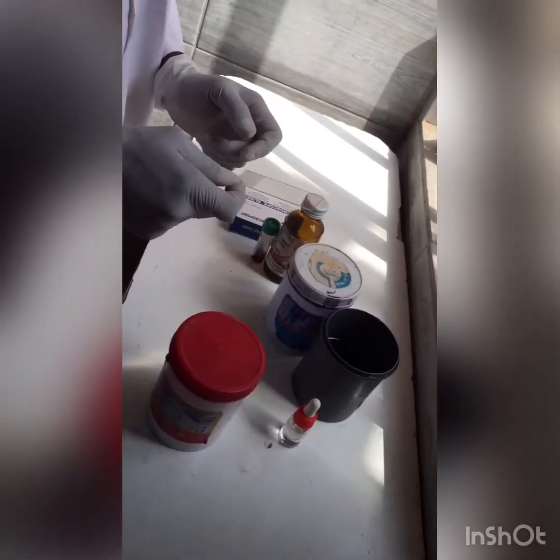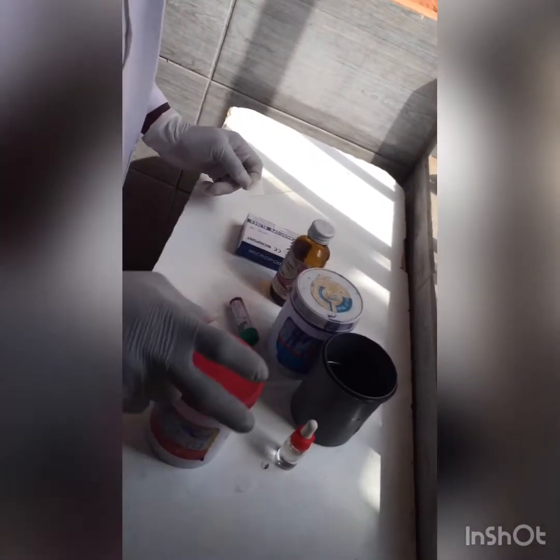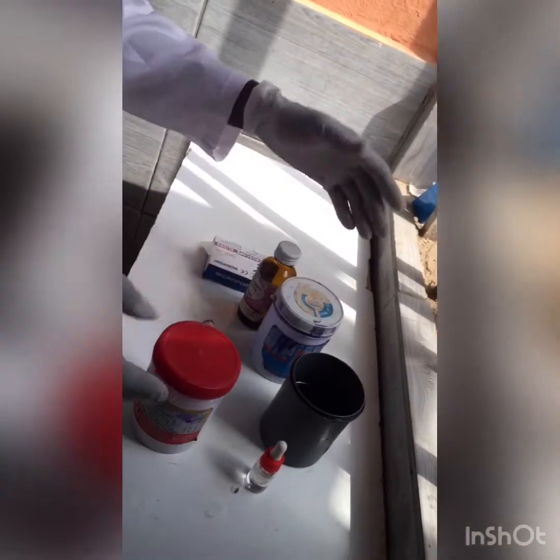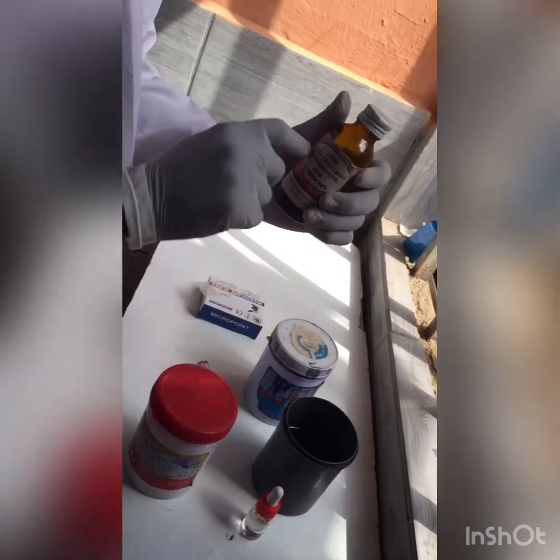For this procedure we'll be needing our glass slide, the blood sample, we'll be needing our Field stain A and B — my own is already in a container — and also we'll be needing clean water, and we'll be needing oil immersion.